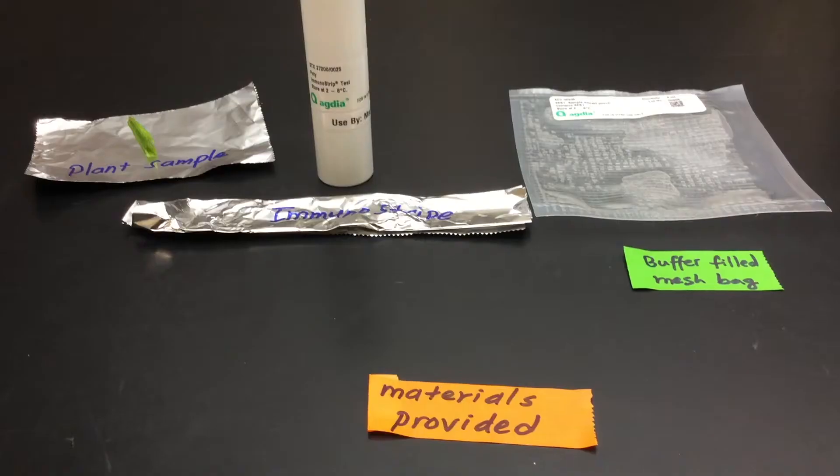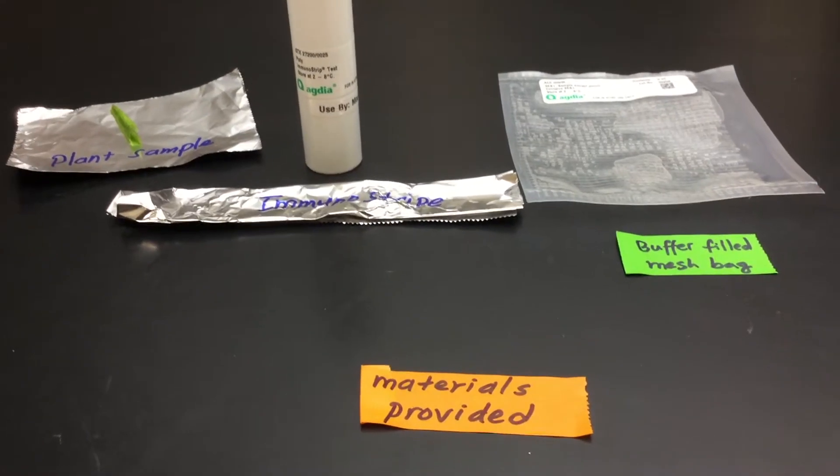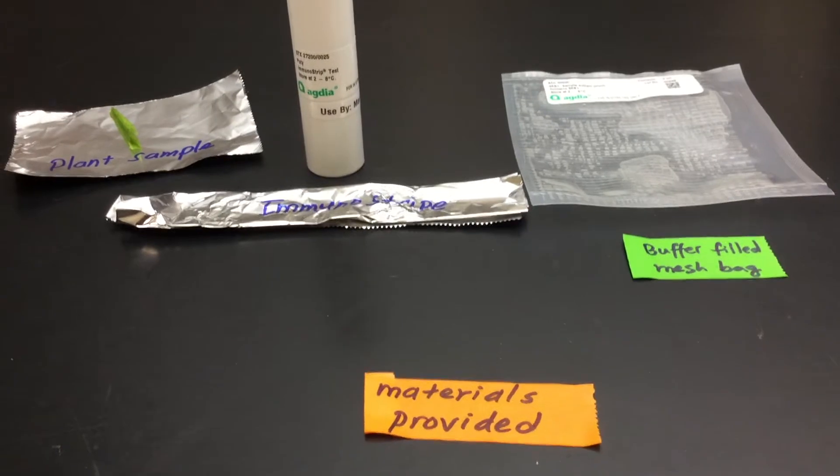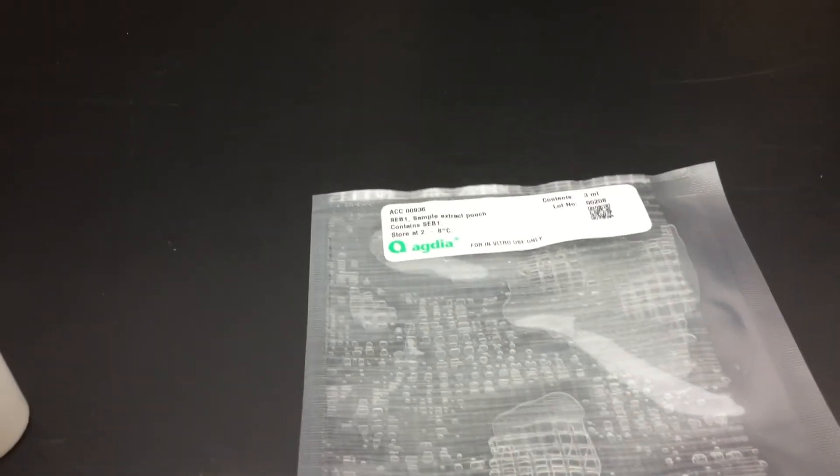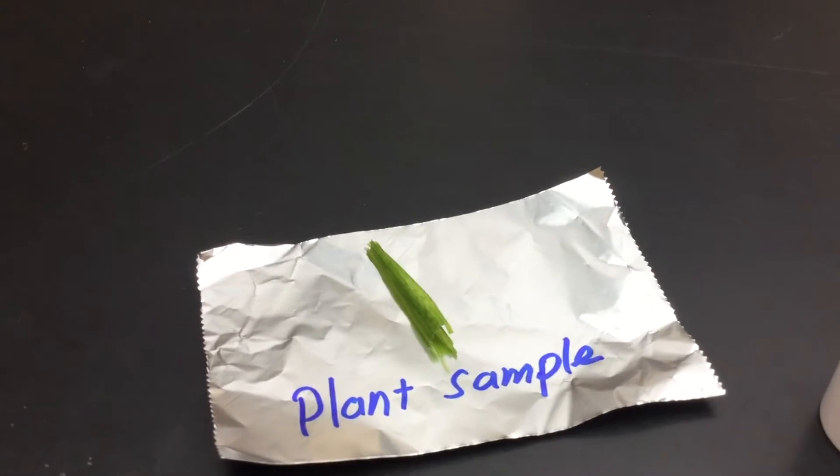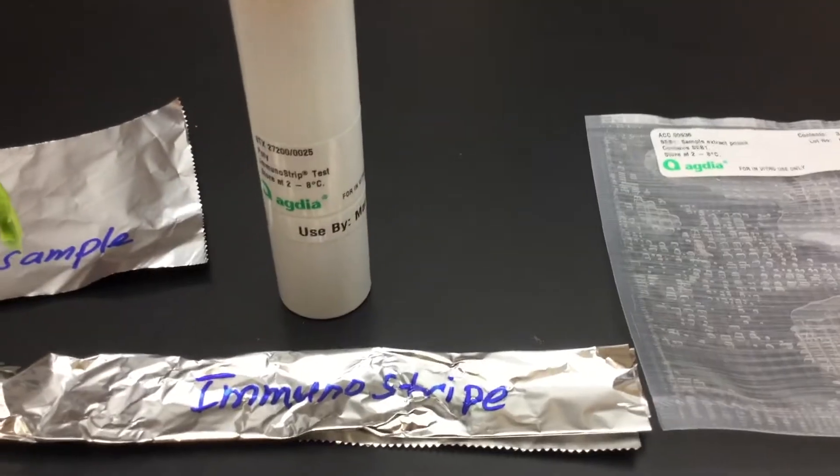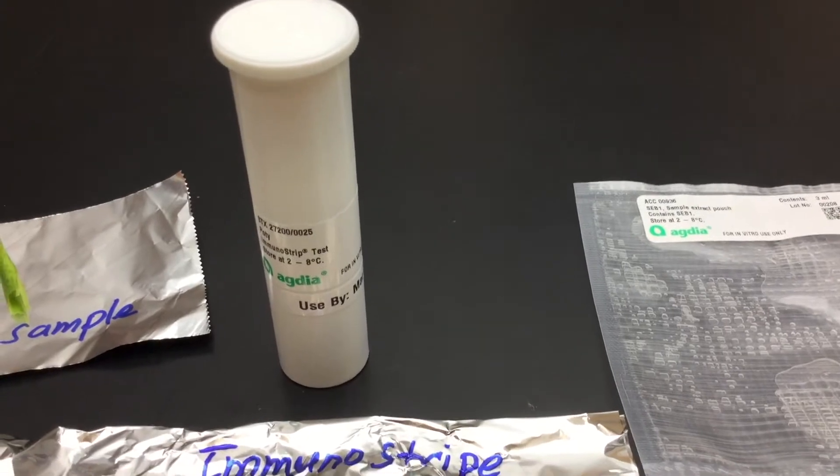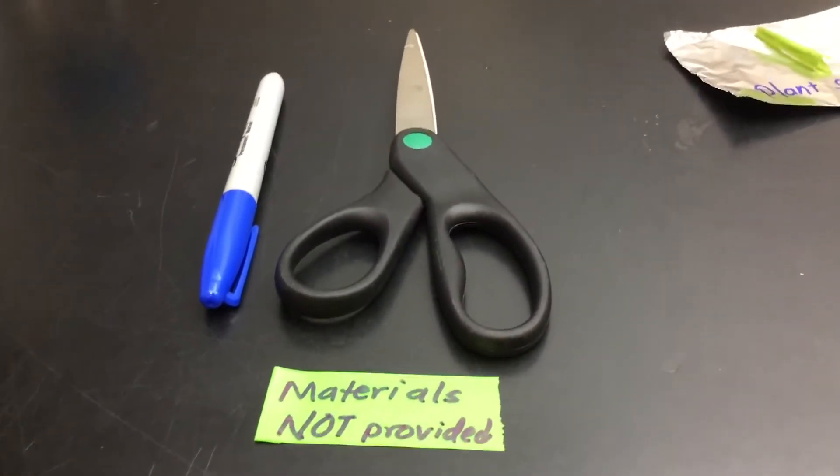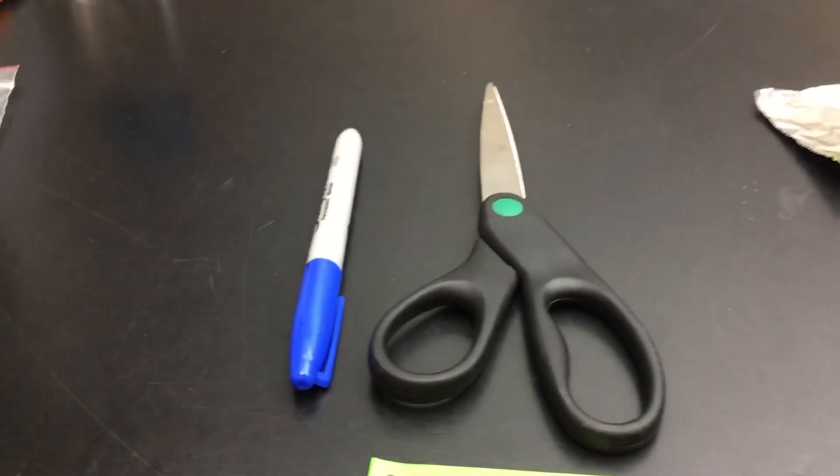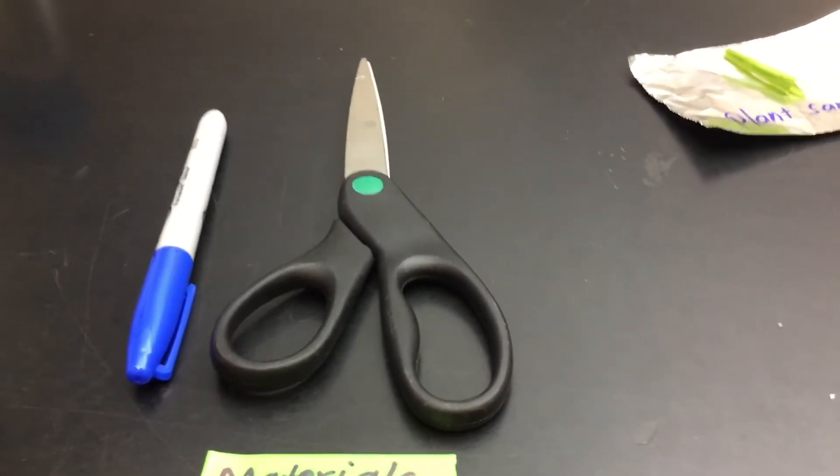Let's talk about the materials required for this test. The materials supplied for you in this class are a buffer-filled mesh bag, plant sample, and an immunostripe. The extra materials needed that are not supplied are a sharpie or marker or any blunt-end object and scissors.